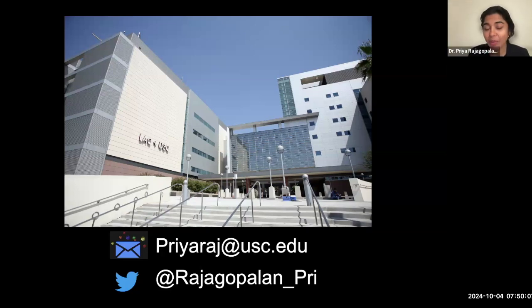That's a great question. So typically when MRI is contraindicated, we obviously first start off with CT. We look for any osseous remodeling, and we look for lytic or sclerotic lesions, but it doesn't give us a great look at the actual canal contents, right? So you want to look at the spinal cord, which is going to be very challenging. So we tend to do CT myelography.